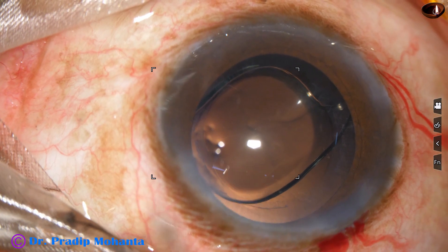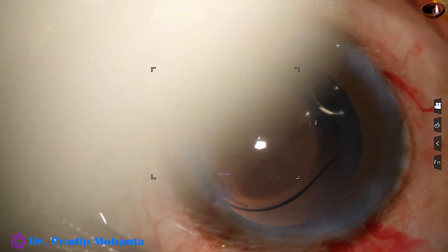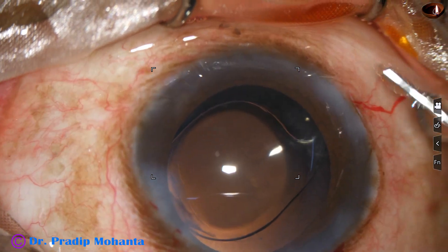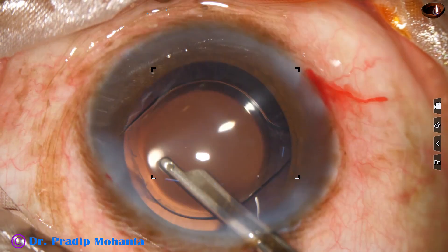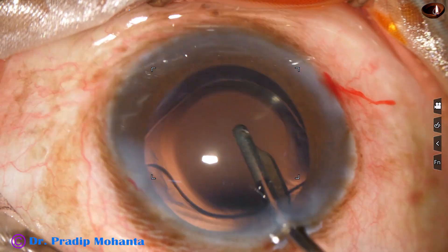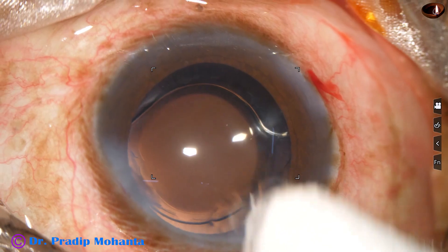This is a bit of moxifloxacin. The side ports are closed by hydrating the corneal stroma on either side of these stab incisions. Finally, anterior chamber lavage is carried out using Simcoe and balanced salt solution. The lens is nicely centered and has opened up nicely. The anterior chamber is formed nicely, integrity of all wounds is checked, and few drops of moxifloxacin are applied over the ocular surface. The case is concluded.